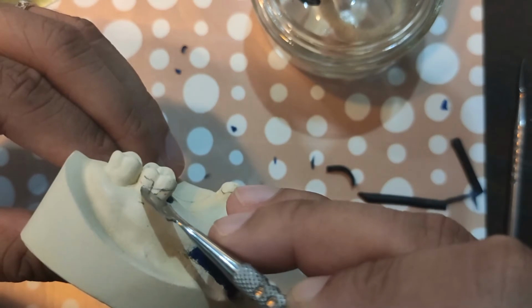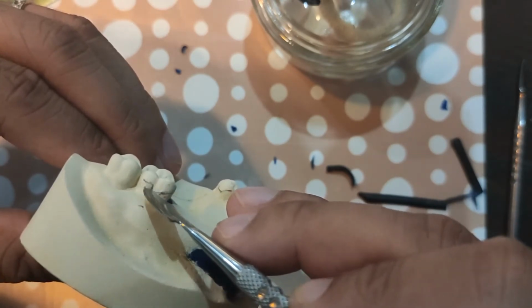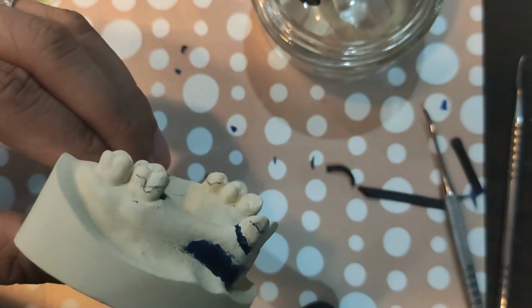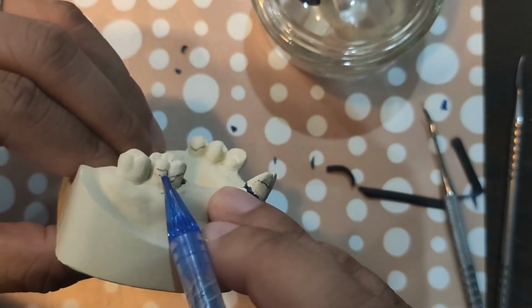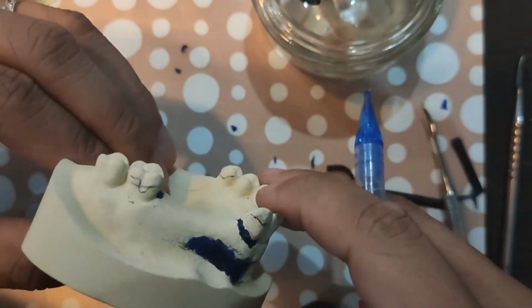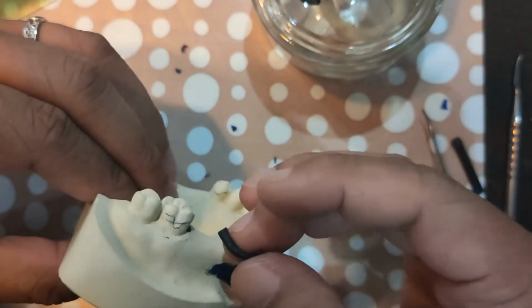And then it dips into the retentive undercut on the flexible third. So basically, the outline of my C-clasp, the inferior border, would look like this. And that's what I need to block out with a ledge.